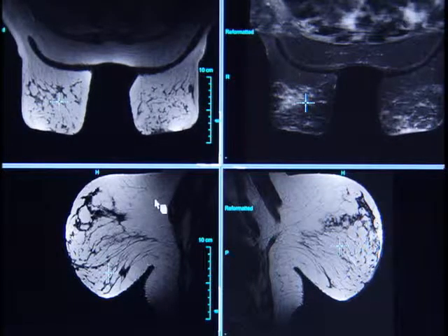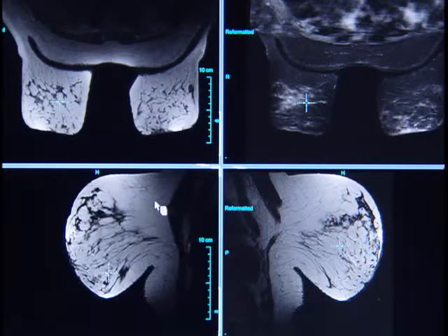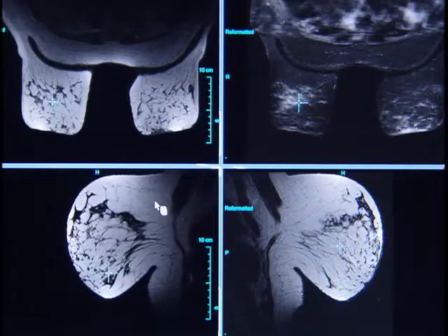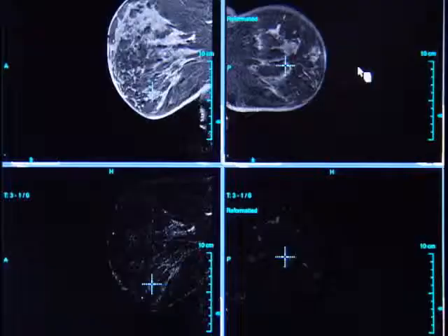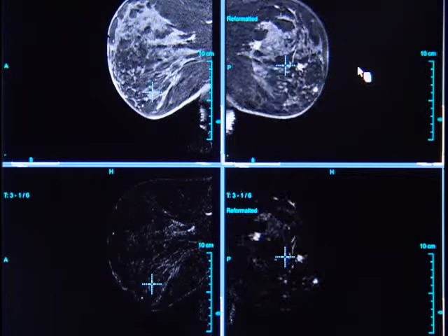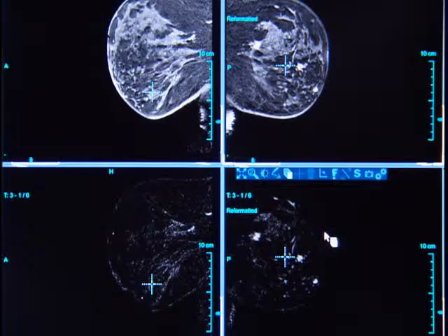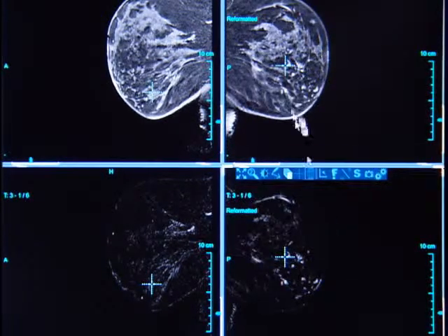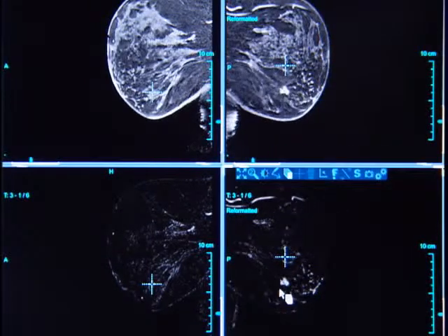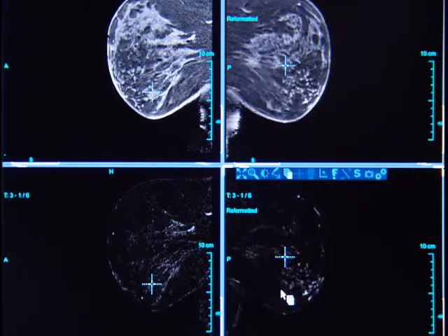Also imaged are sagittal fast spin-echo T2 acquisitions without fat saturation. Also on this hanging protocol, we have the raw data one-minute fat-saturated post-gadolinium images on top of the one-minute subtraction images. This allows you to demonstrate the true anatomy as well as the enhancement kinetics simultaneously.